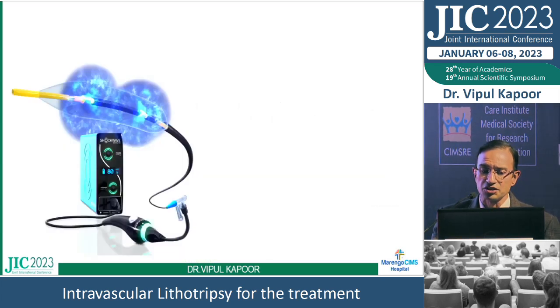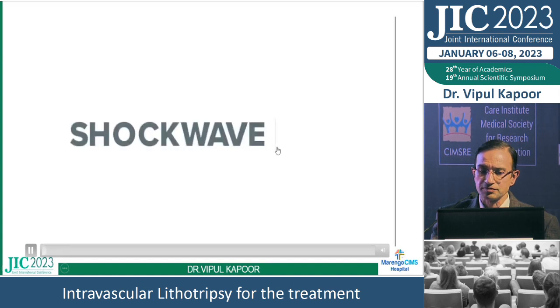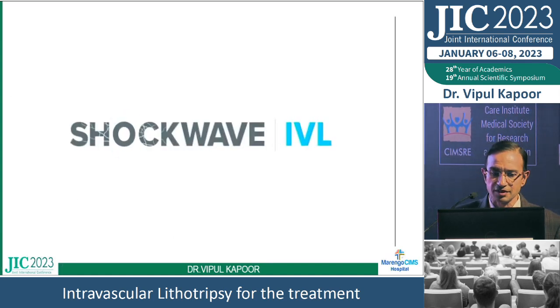And then comes this technology, which we call intravascular lithotripsy. So don't be surprised. It is one of those videos. I'm breaking the calcium.